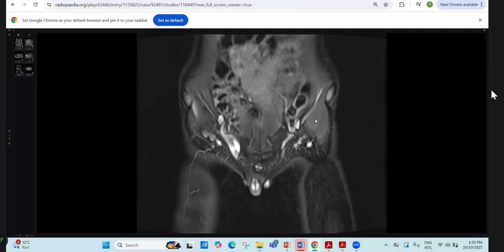Okay. You did really well after I helped you a little bit, because if the examiner is not helping, he could change the film, giving you whatever marks he would want to give you. So, it was Ewing sarcoma. The rest of you did really well after that.